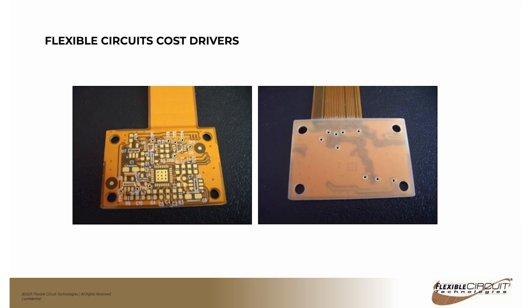And this particular design is going to be quite a bit less expensive than a rigid flex. So keep that in mind when you're doing your design. If you can keep all your components and soldering on one side, we can do just a standard flex, and that can save you some money. And functionality-wise, it's going to be exactly the same as a rigid flex.